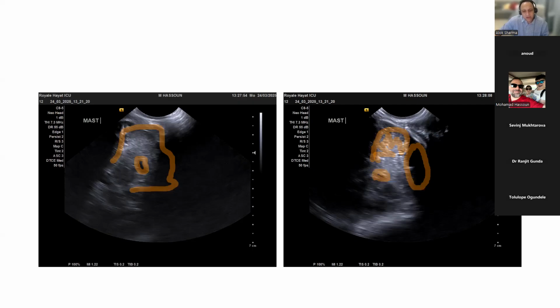The other cerebellar hemisphere is coming in over here. It's not unusual when you have small windows to be able to see the ipsilateral cerebellar hemisphere very well, but not be able to see the other. But once you get it, really what you want to do is measurements, and I'll be talking about them in a class going forward.